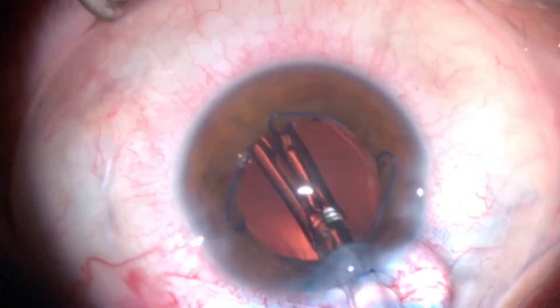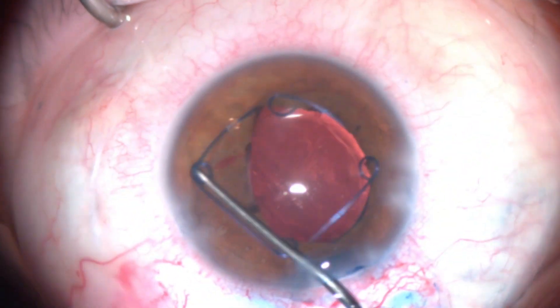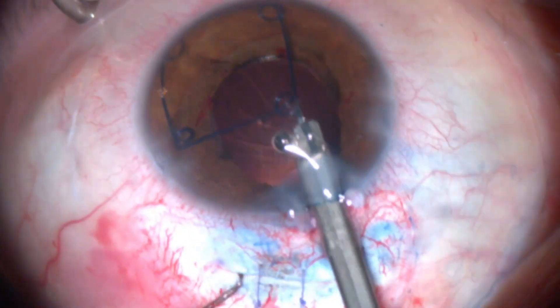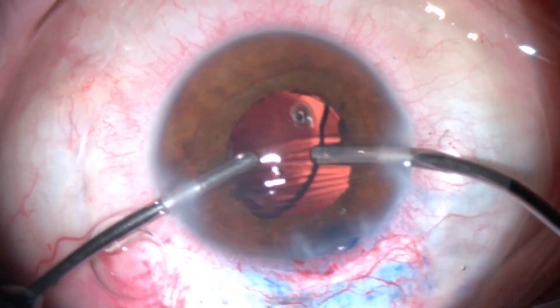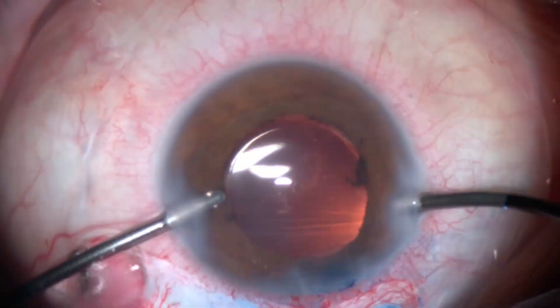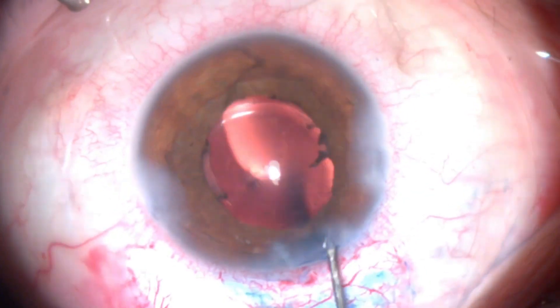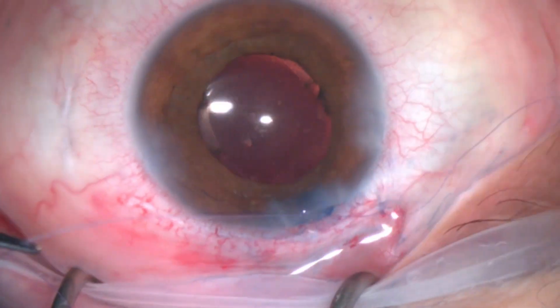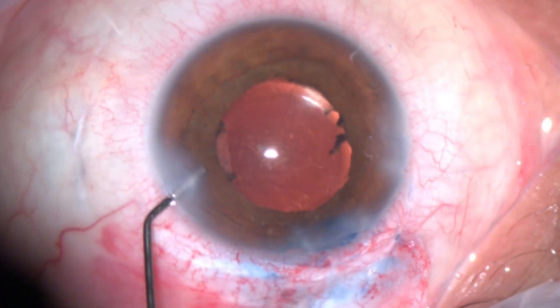Then inserting a single-piece acrylic lens. Once the lens was in place, the Malyugin ring was removed in the usual manner. We proceeded with irrigation and aspiration to clear any remaining viscoelastic and residual lens fibers. The wounds were hydrated, the conjunctiva was closed with thin Vicryl suture, intracameral antibiotics were injected, and the surgery was concluded.